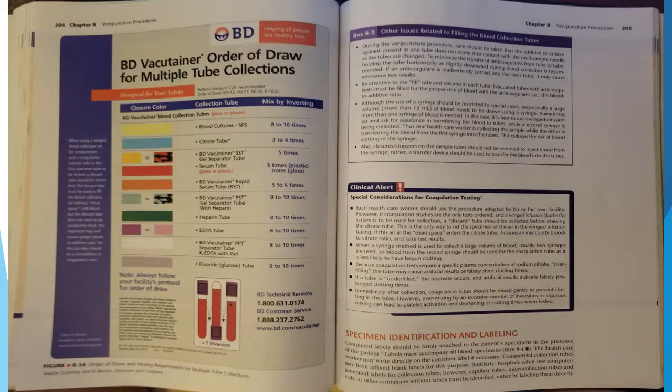Thus, one healthcare worker is collecting the sample while the other is transferring the blood from the first syringe into the tubes. This reduces the risk of blood clotting in the syringe. Also, closure stoppers on the sample tube should not be removed to inject blood from the syringe. Rather, a transfer device should be used to transfer blood into the tubes. Clinical alert, special considerations for coagulation testing. Each healthcare worker should use the procedure adopted by his or her facility.